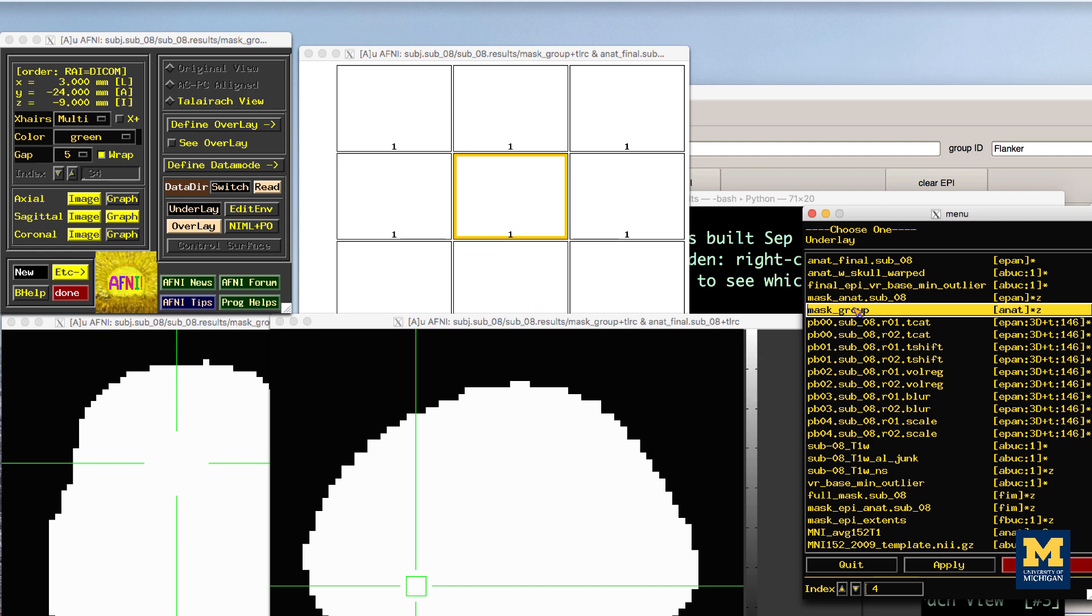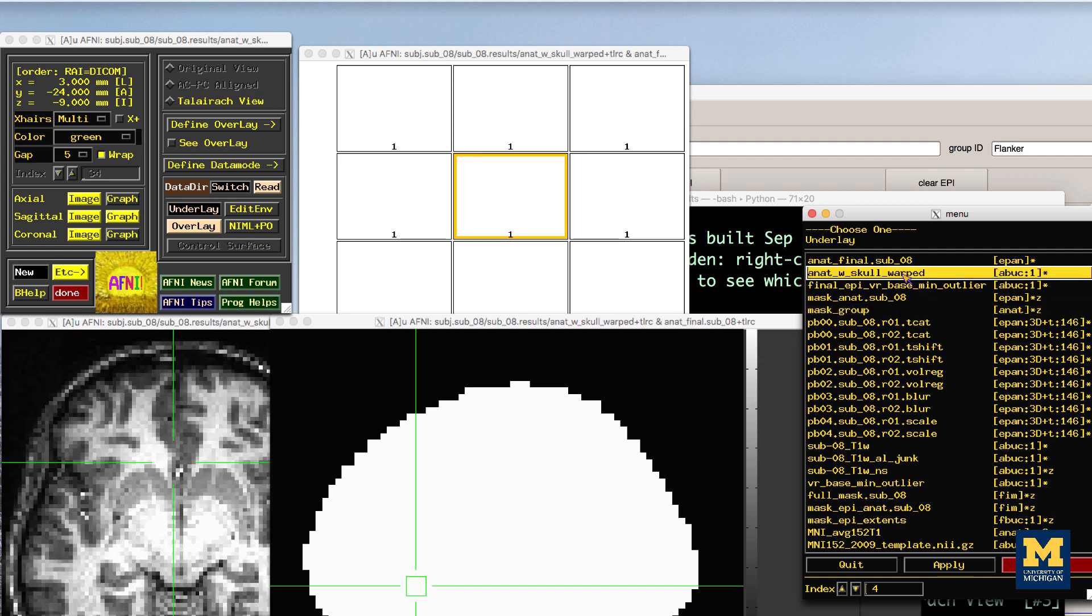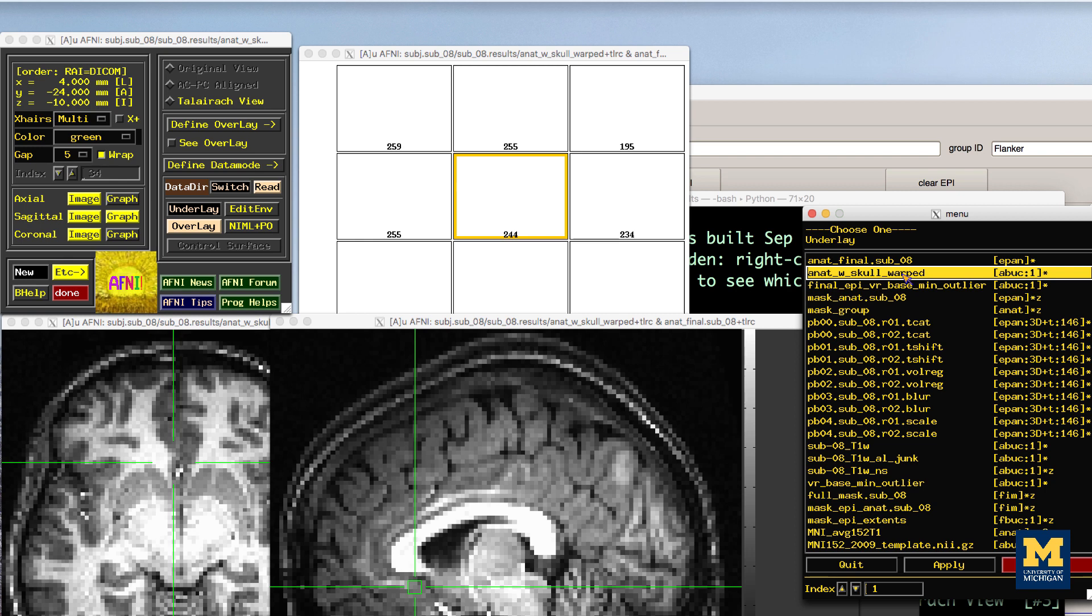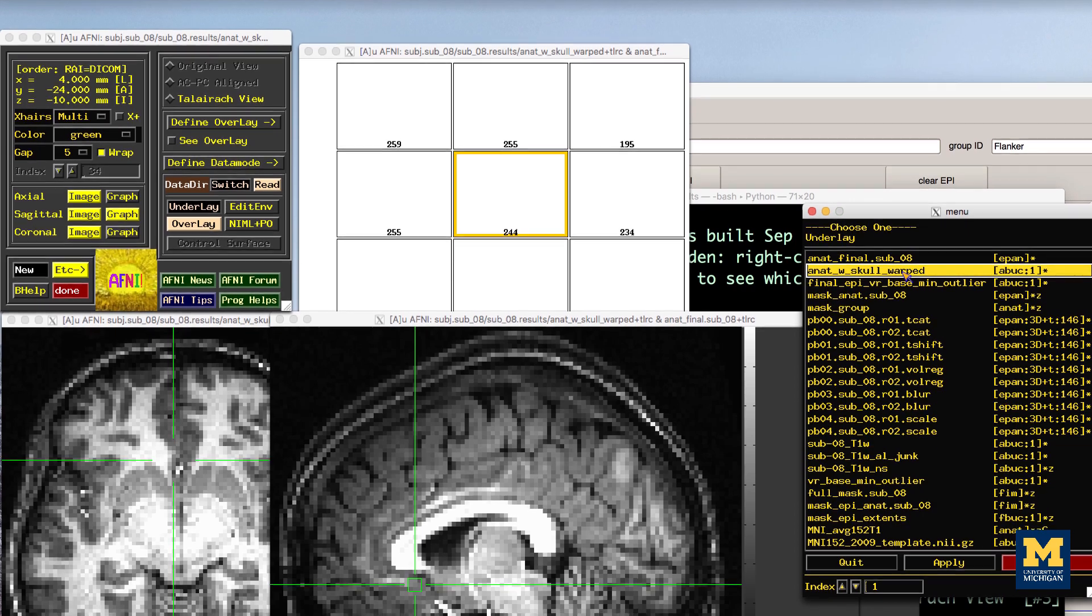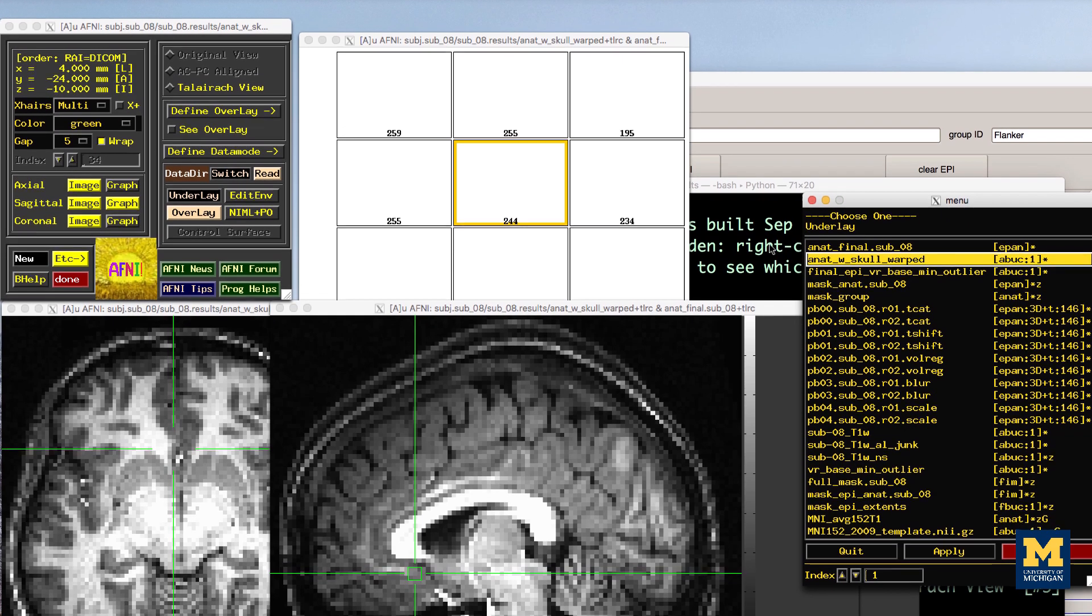When viewing the results of the anatomical preprocessing, we will want to make sure that both the skull stripping looks reasonable and that the images were normalized properly. First, open the image ANAT_with_skull_warped.